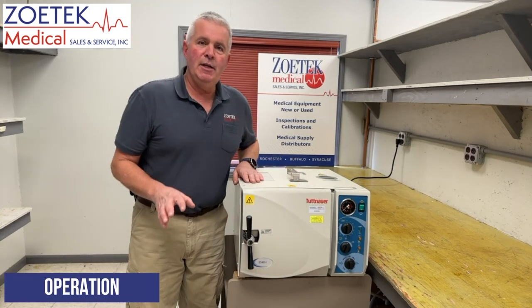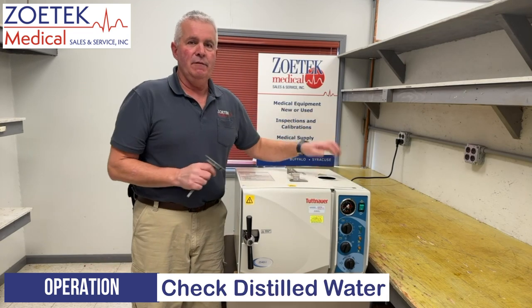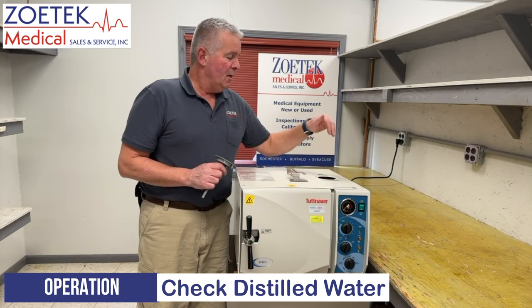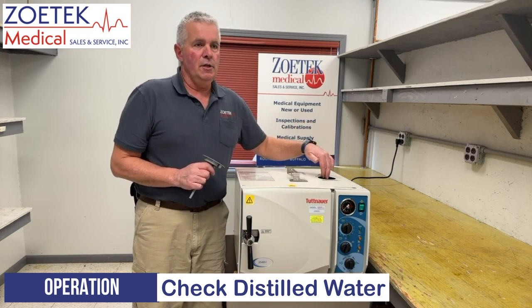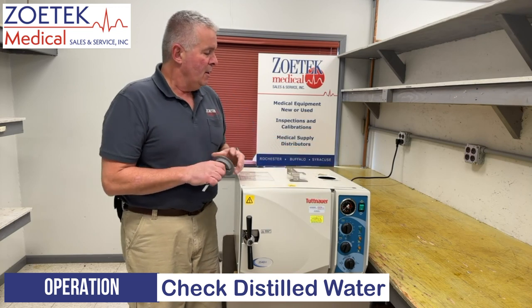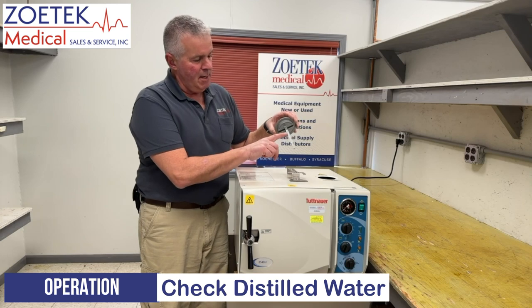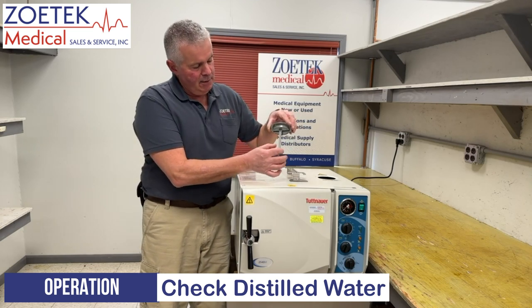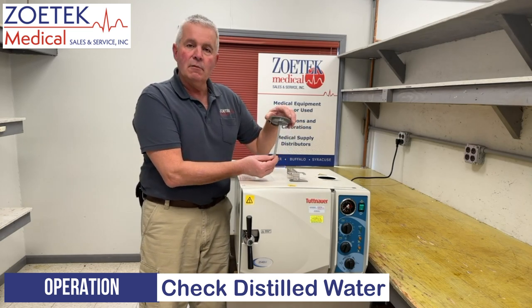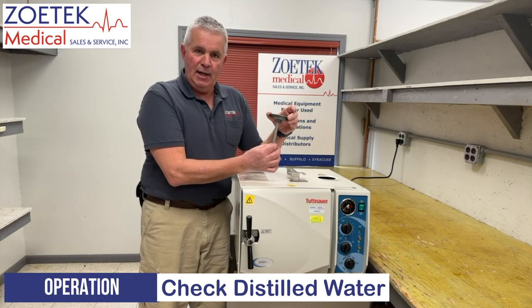The very first thing we need to check on the sterilizer when we come up to it is to make sure that we have plenty of distilled water in our reservoir on top here. Only distilled water goes in here — never use tap water or any other kind of water. The cover has a min and max line that will indicate your operating water level, so the water level should be in that area.